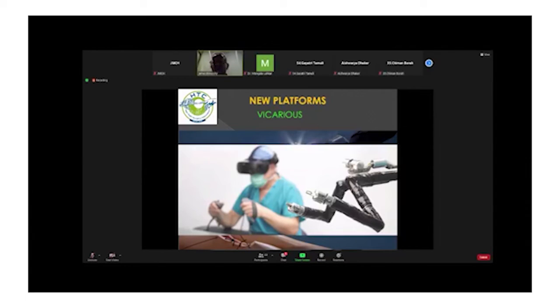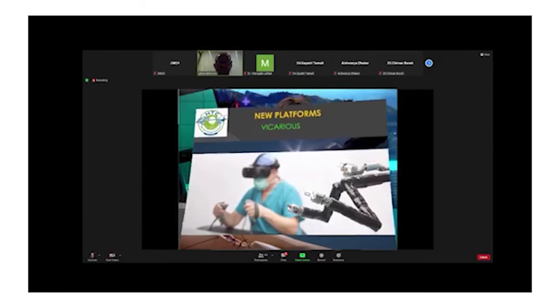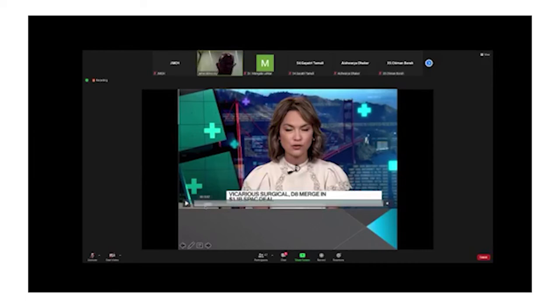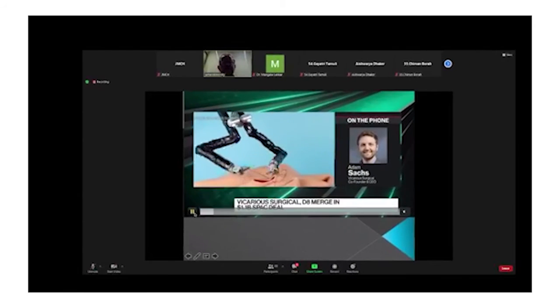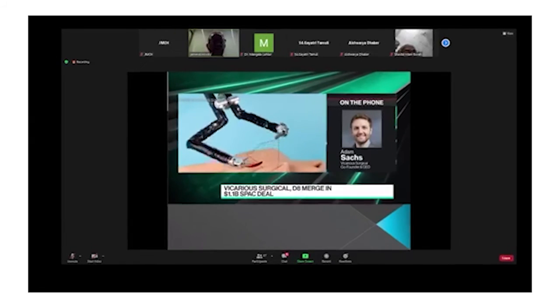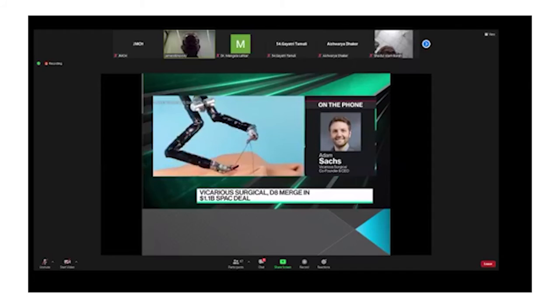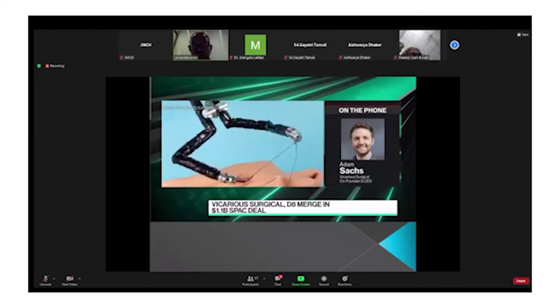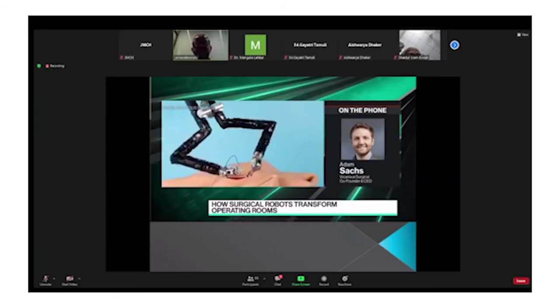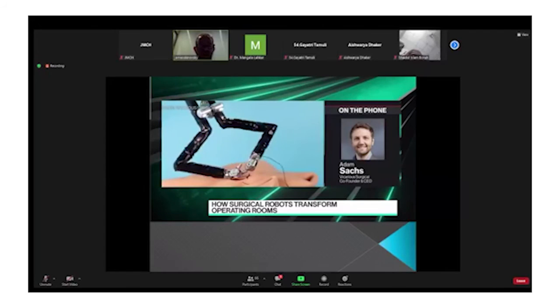The little creature is just imitating the movement of the surgeon. If the surgeon moves his head to a side, just a minute, the platform is going to imitate him. Imagine this one in some time from now, miniaturized inside the cavities of the human body, performing surgeries, performing procedures, and improving the lives and making the recovery time faster in our patients. It's really, really absolutely fantastic.